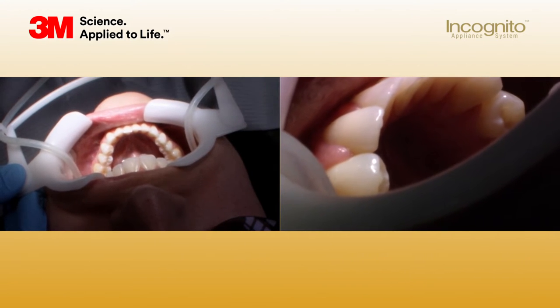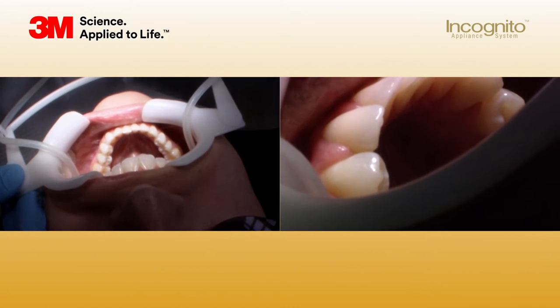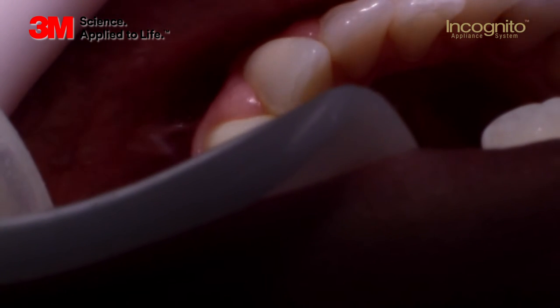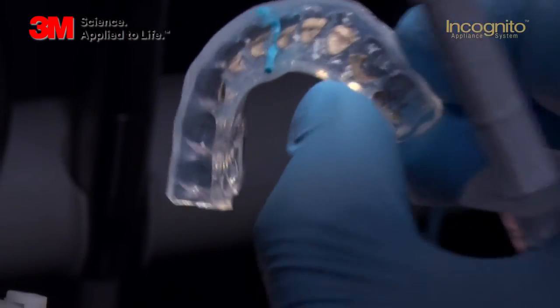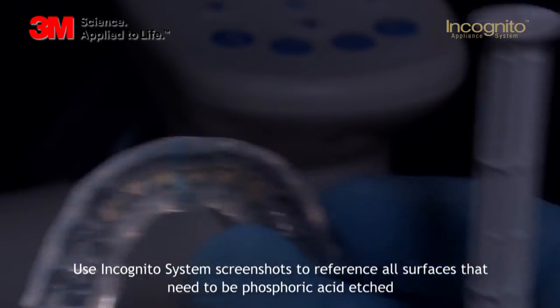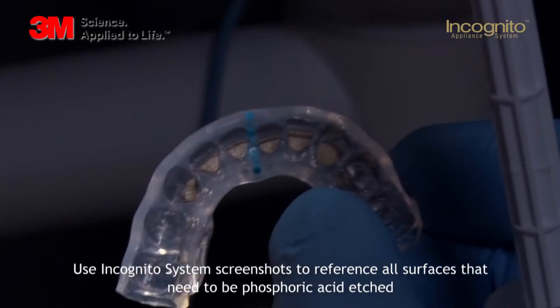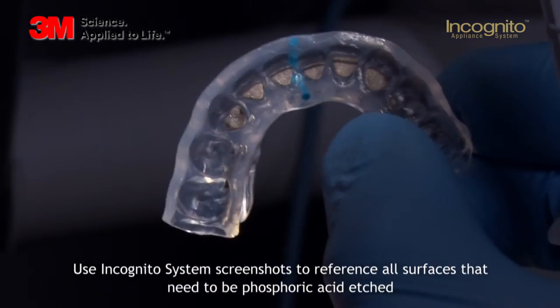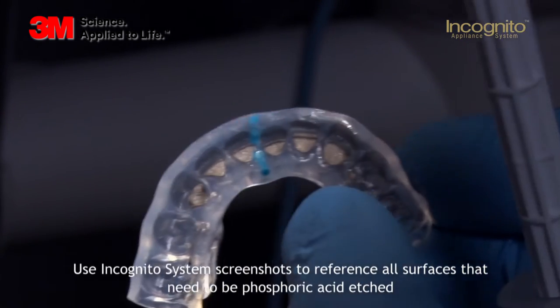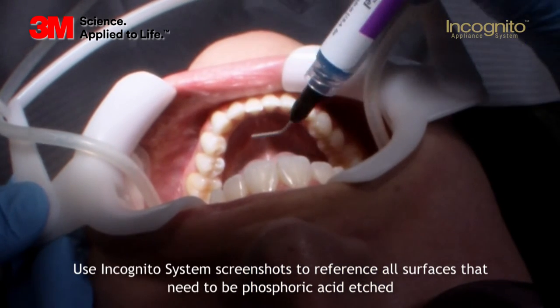When you've checked the fit of the tray, we will etch the lingual surfaces. To check which lingual surfaces you want to bond, always look at the tray — what type of bracket design you have chosen for your appliance — to verify which tooth surfaces you need to etch. You also have the opportunity to print out the bracket design on a piece of paper and lay it next to you to double-check the design of the bracket and where you need to bond. This is how we're going to bond the lingual surfaces.